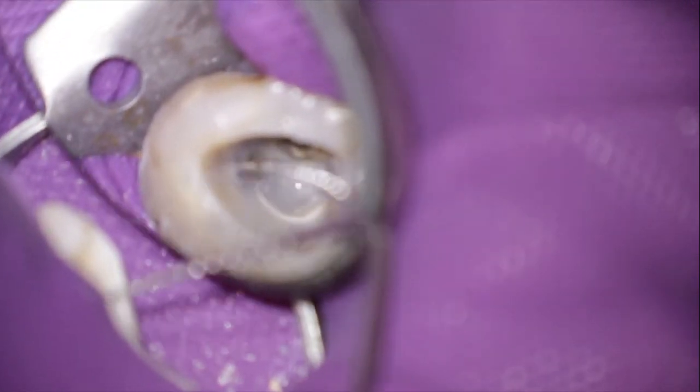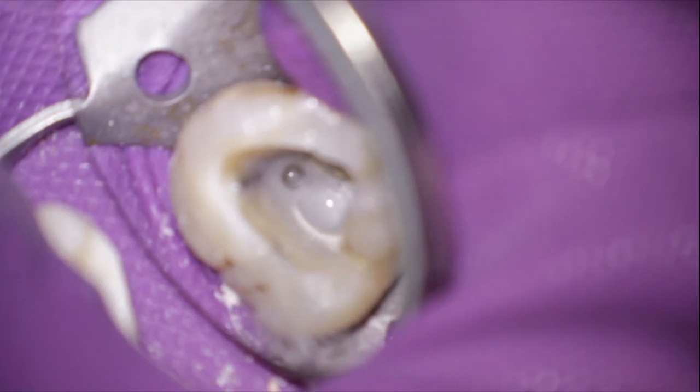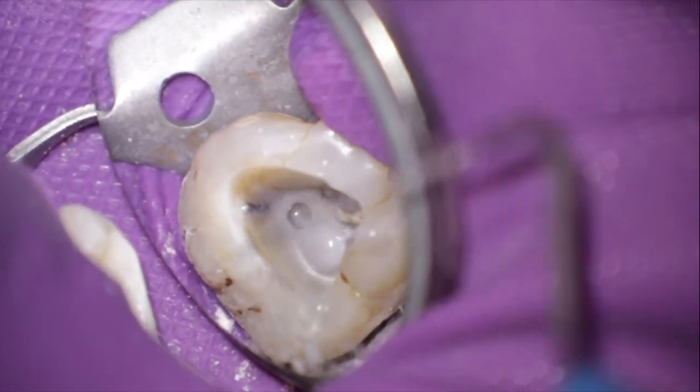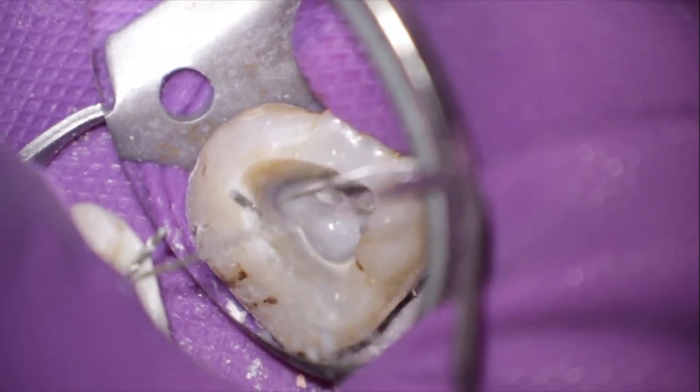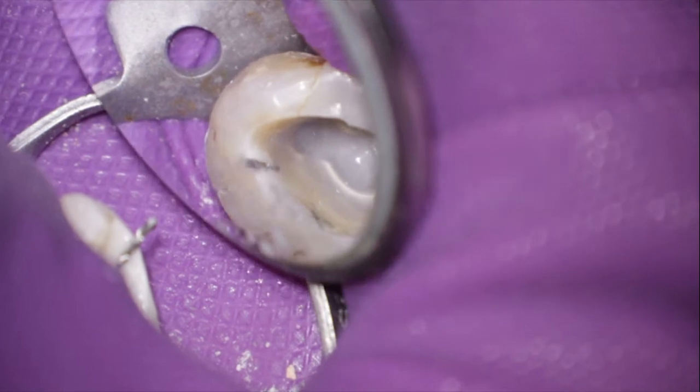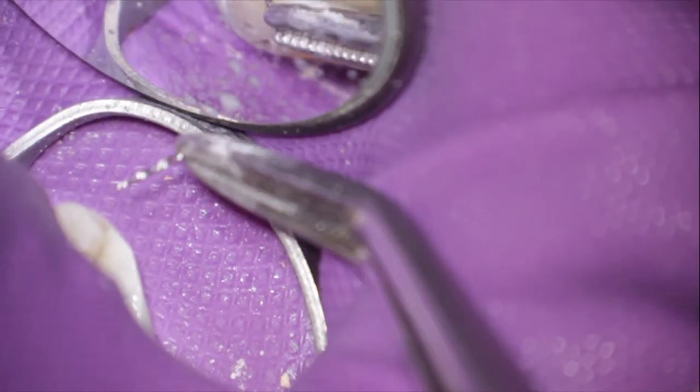Now you can easily imagine the massive power that the ultrasound tip delivers to the sodium hypochlorite or any other fluid. Now here you can see the fragment in its full beauty, but certainly it is better to avoid any fractures. So I have learned another chapter in endodontics, and highly curved canals in the apical portion are a no-no for any rotary file in the future for me. But maybe in your hand this works better, but I cannot recommend it for sure.